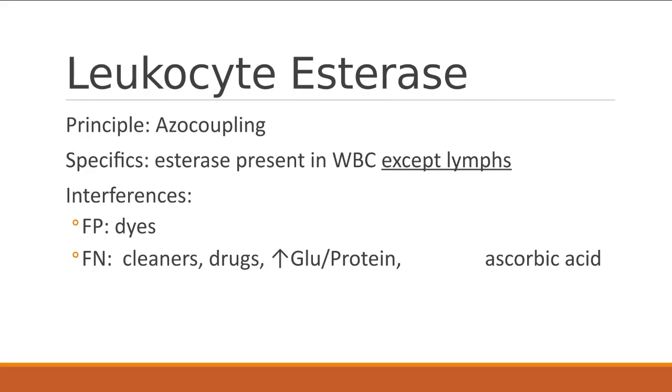It can also cause problems whenever you've stored it incorrectly. Here's your ascorbic acid again. That's going to change it. So those are some things that make it change.